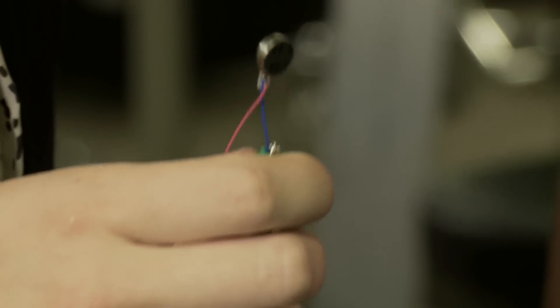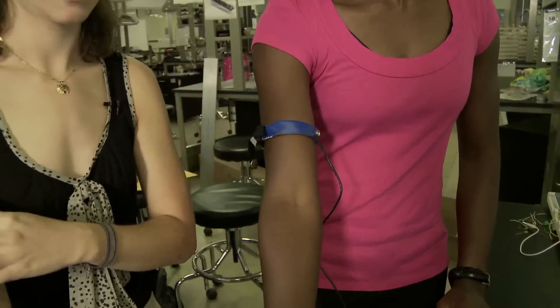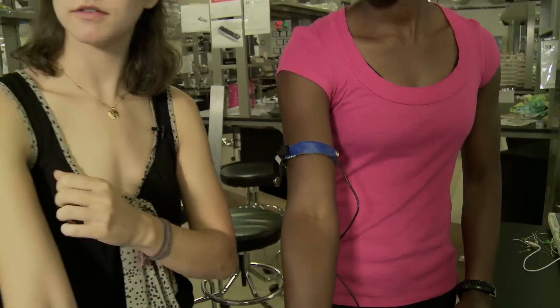When she stops breathing for 20 seconds, the motor starts vibrating and pulses to get her attention and to get her to start breathing again.